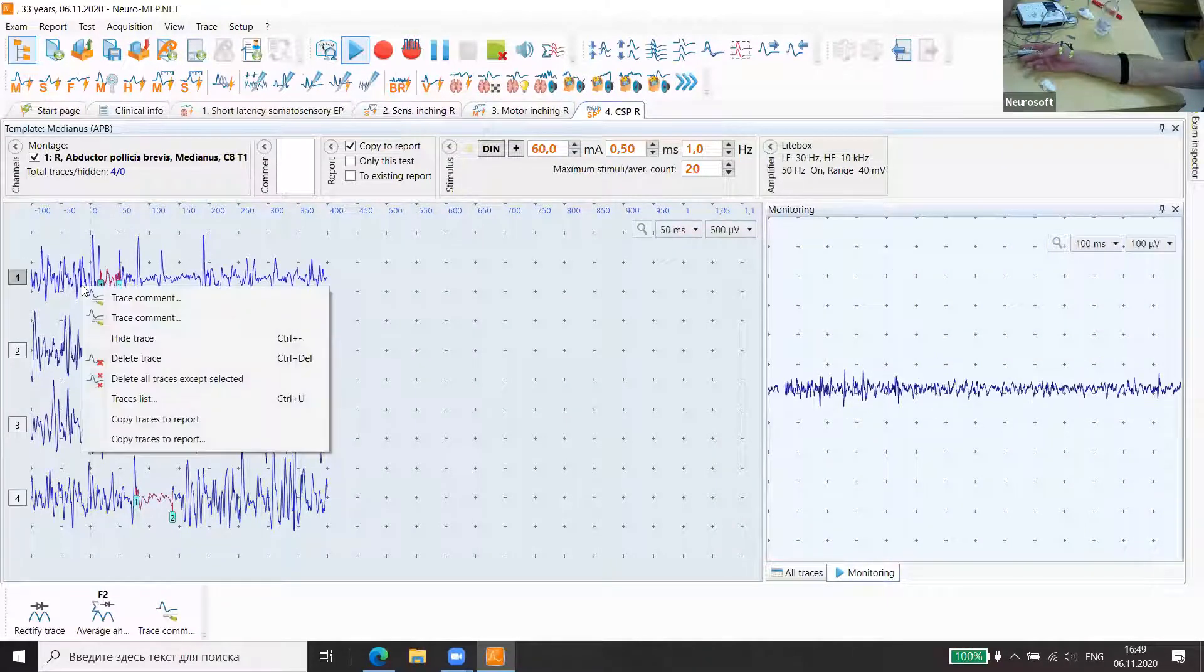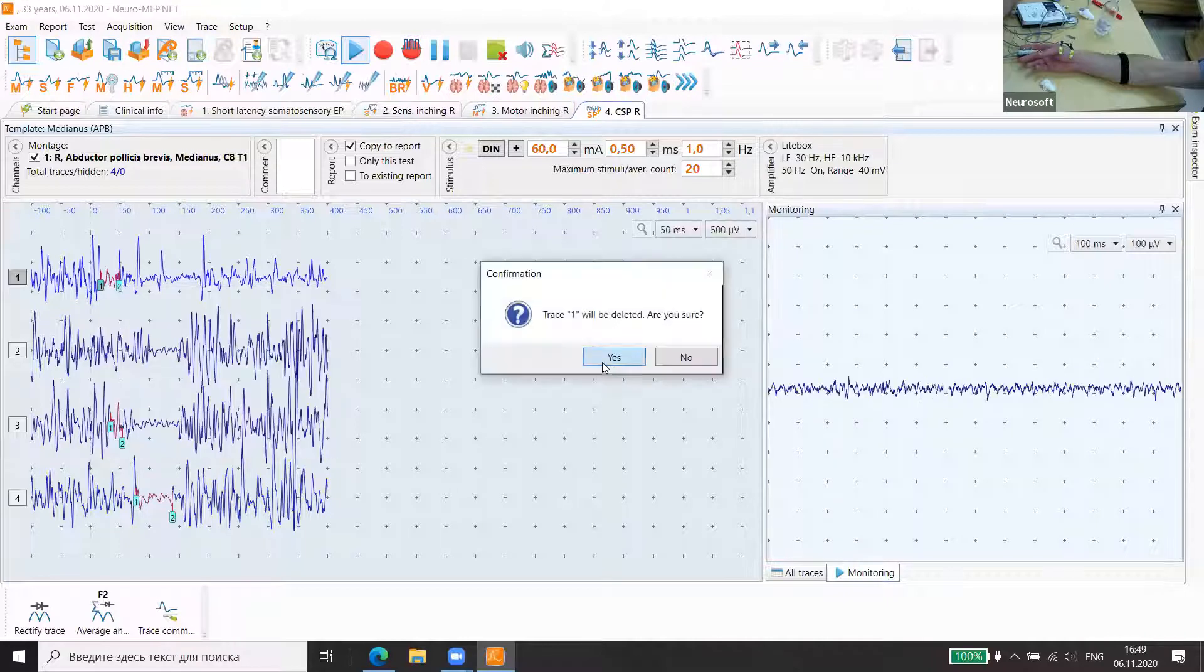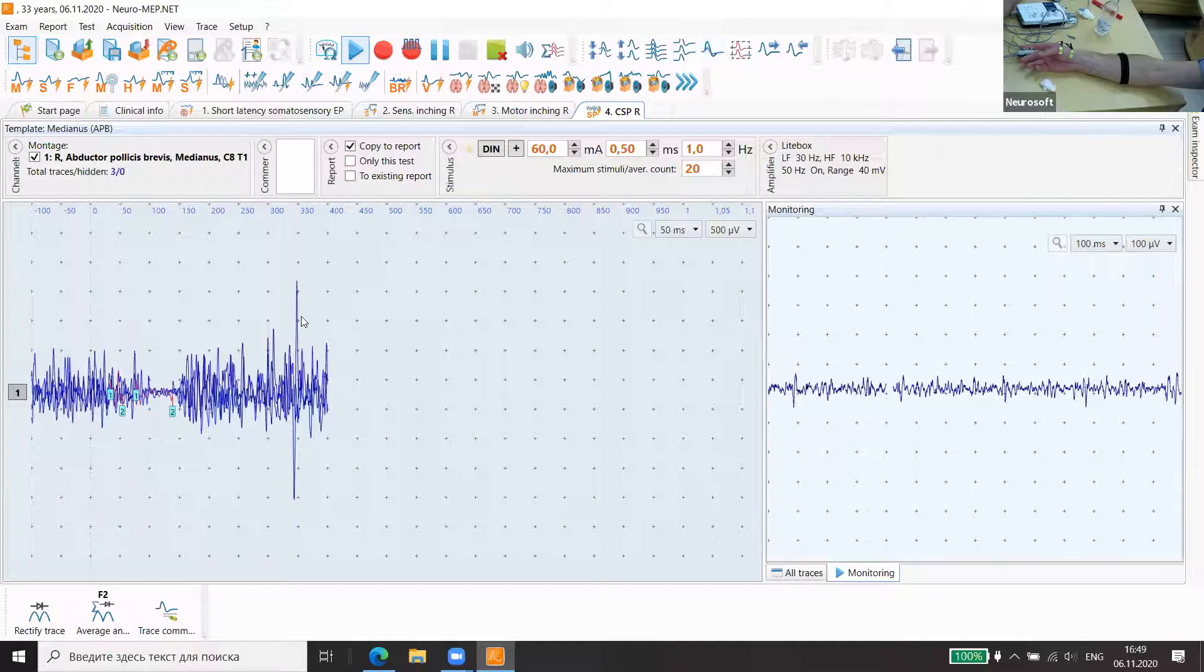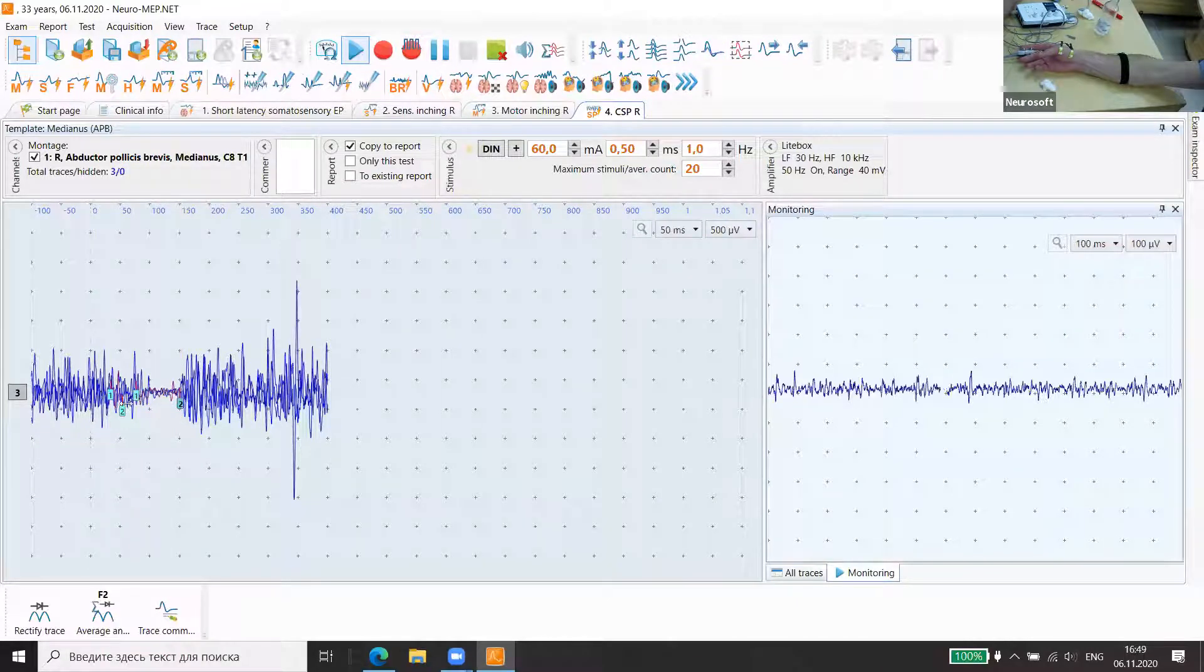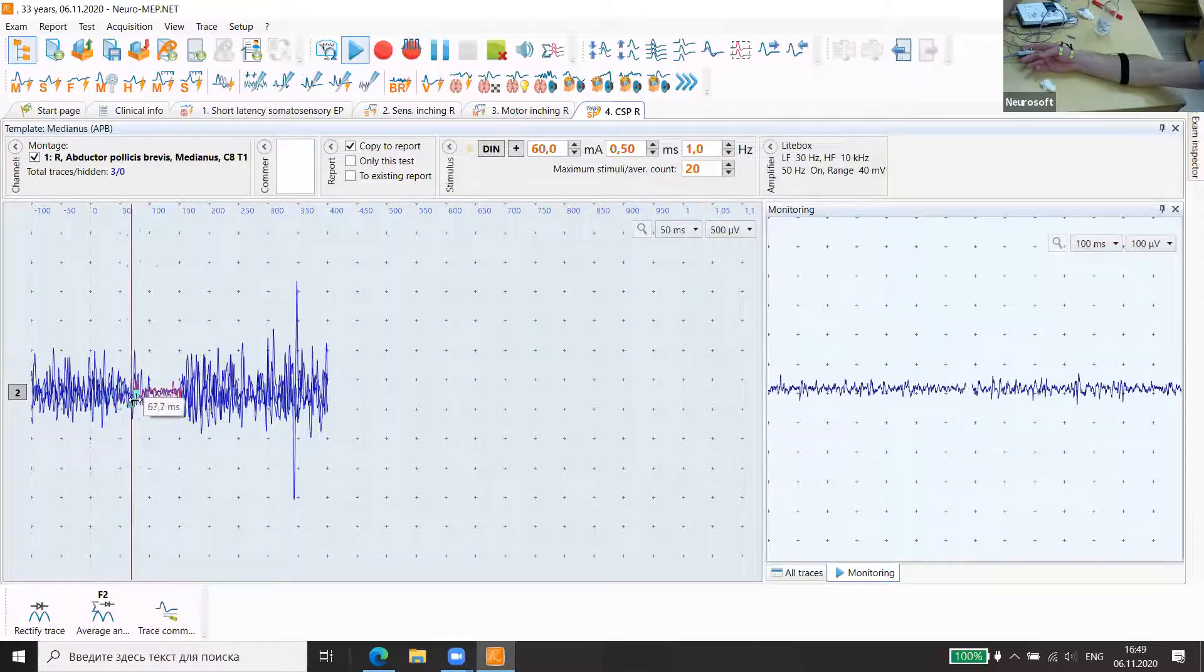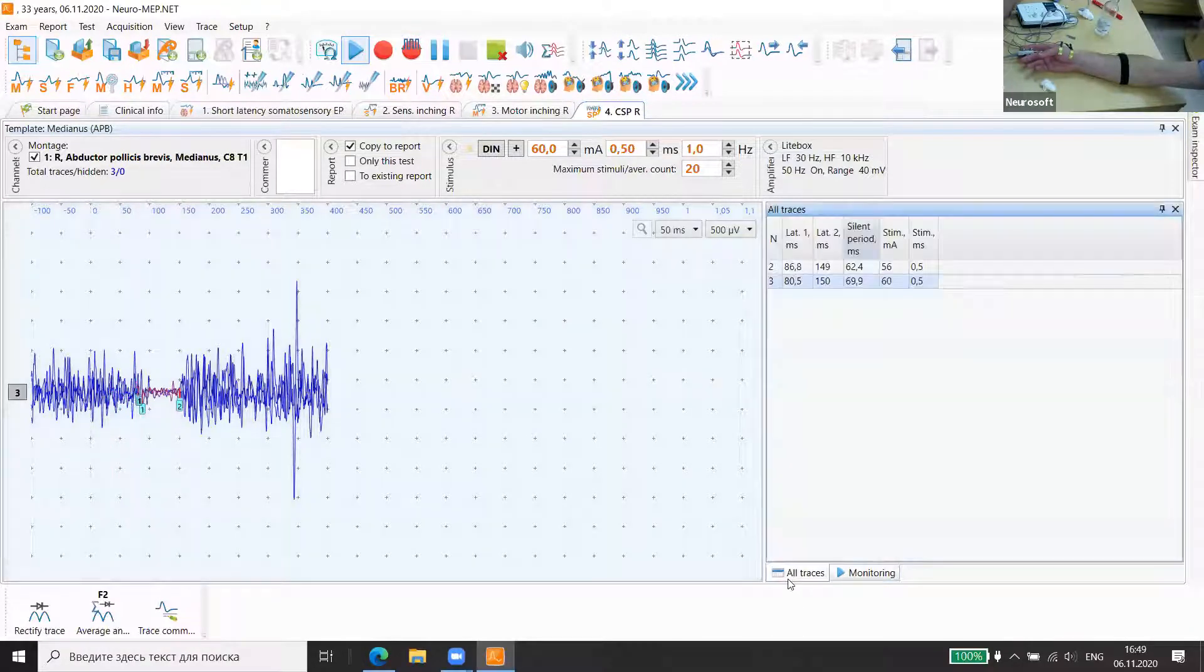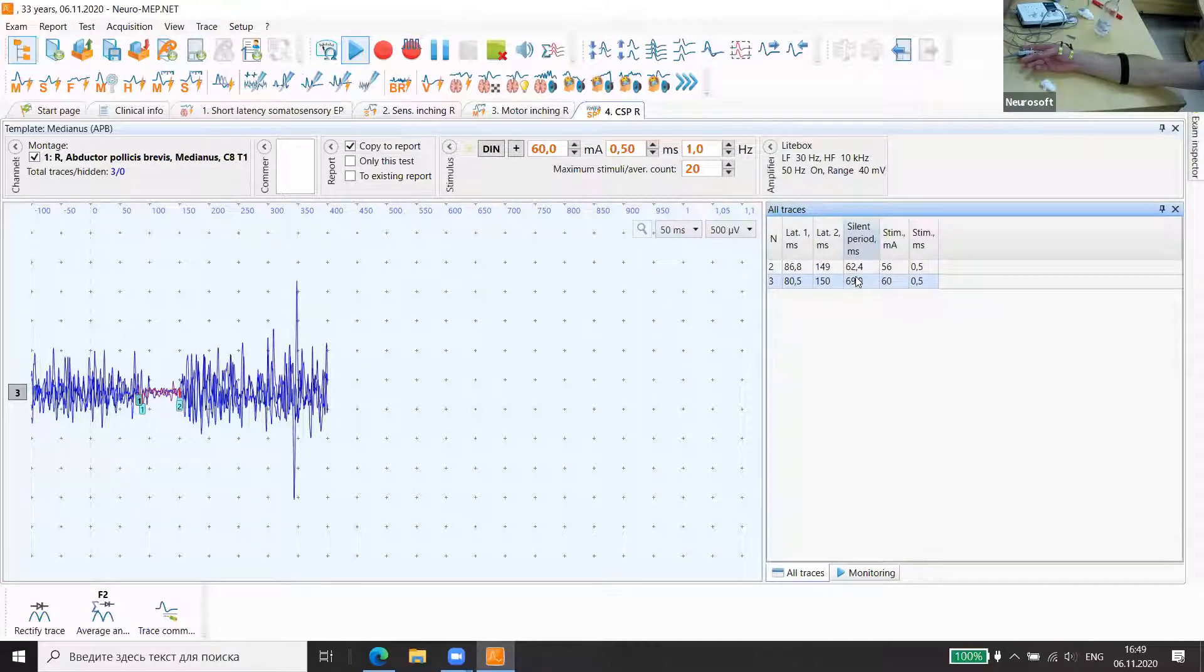We can delete the first trace, but this is okay. We can superimpose them and you can see silent period. It's a classical about 60 milliseconds silent period.